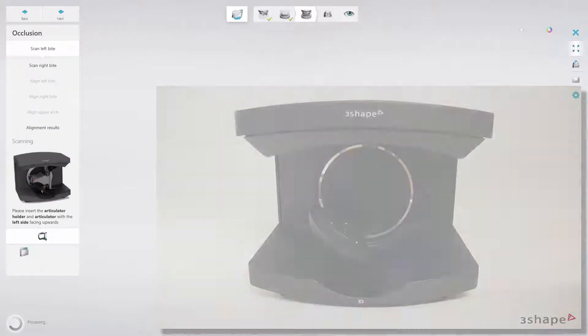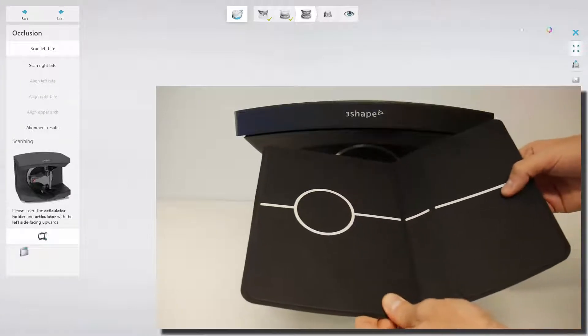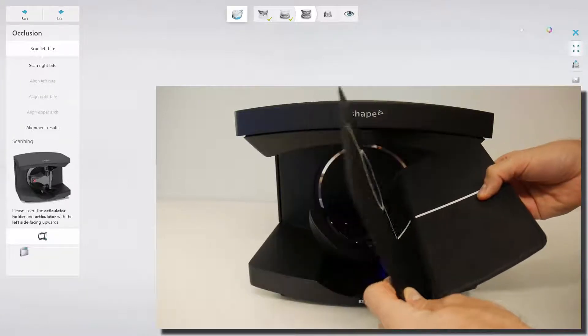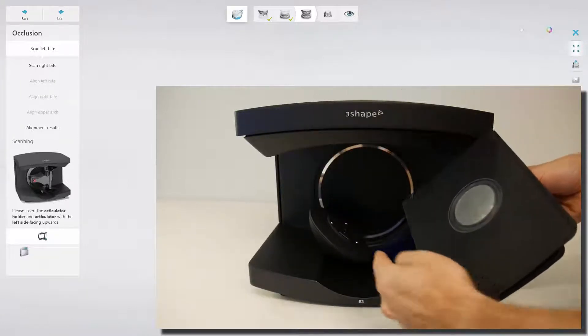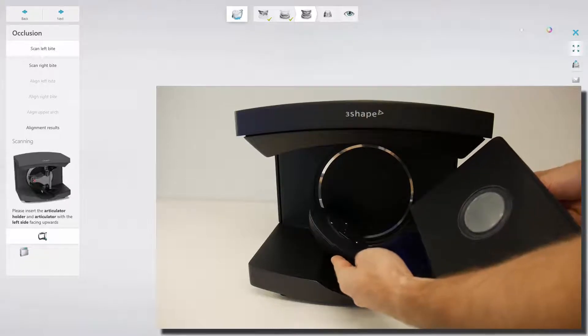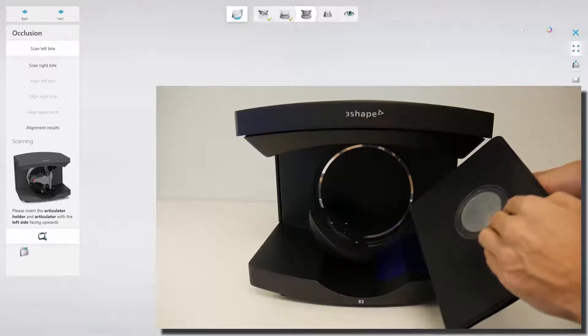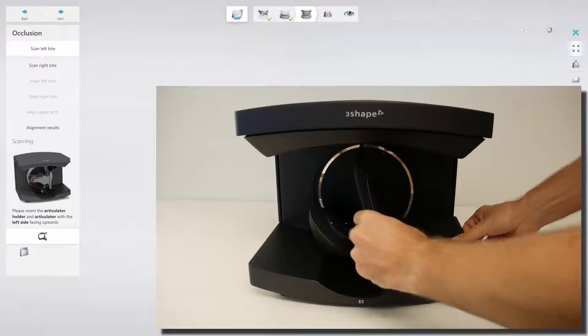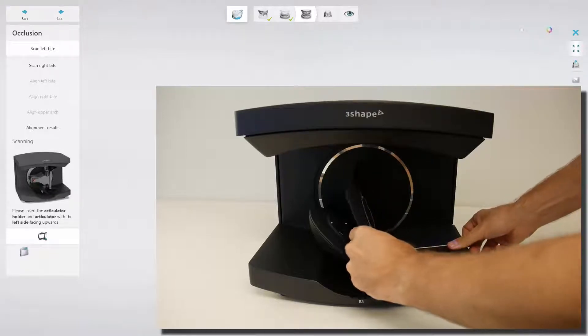Please insert into the scanner the Articulator Holder. It has a magnetic surface that attaches to the arm. The three metal ball points on the arm should fit into the metal rim on the holder. It is necessary to place it into the proper position.